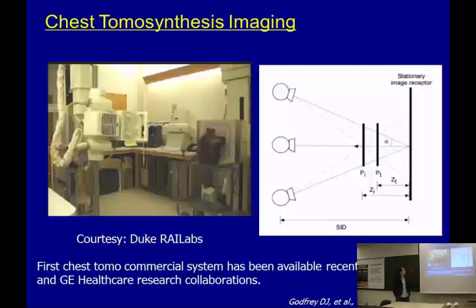Okay, now let's look at some applications in chest imaging. This shows a prototype of a chest tomosynthesis device at my previous group at Duke University. We collaborated with GE Healthcare to develop the device. And currently, chest tomosynthesis is commercially available.